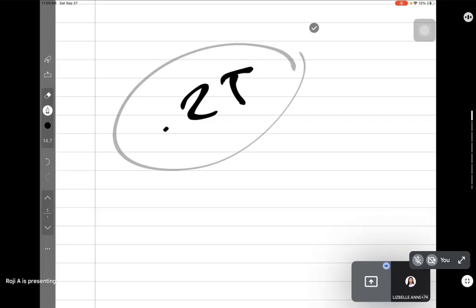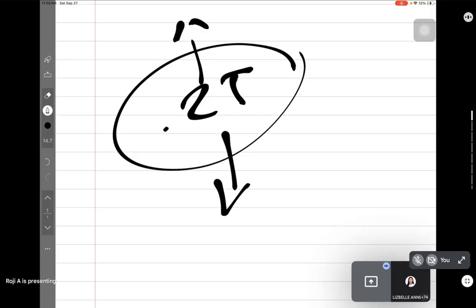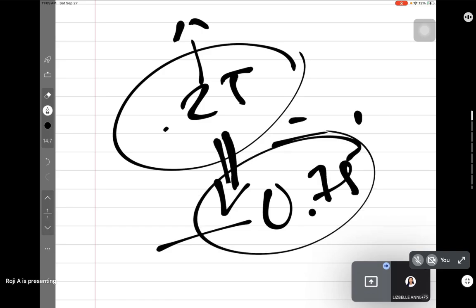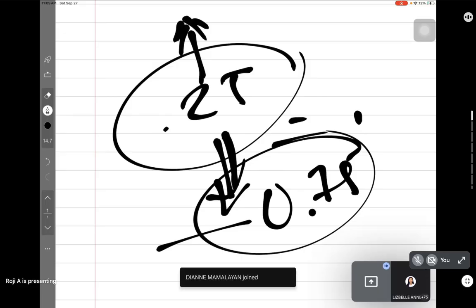For reference, you would notice a 0.25 is actually negligible. So in real practice, whether it's a little higher than 25 or lower than 25, this is still accepted because the negligible astigmatism is up to 75. So this is more or less accepted by the patient.